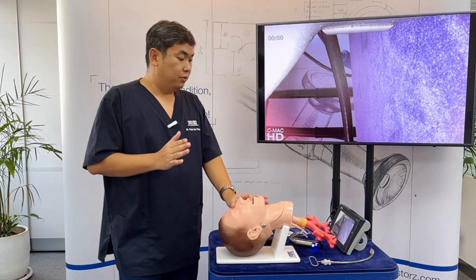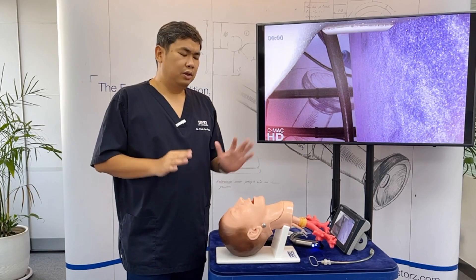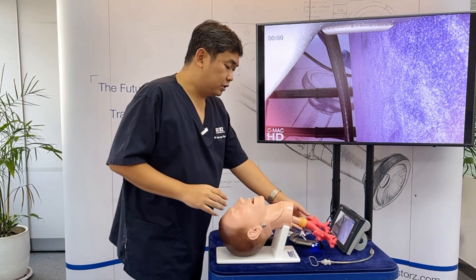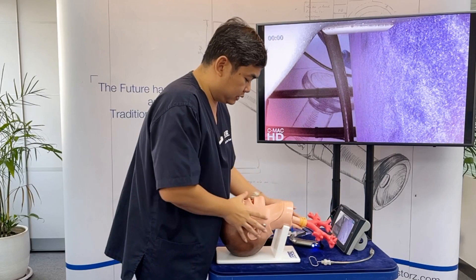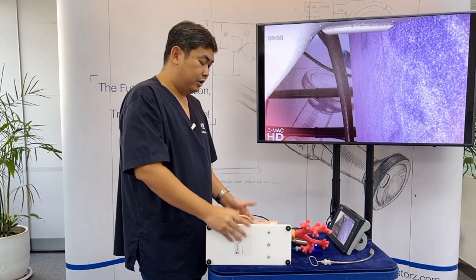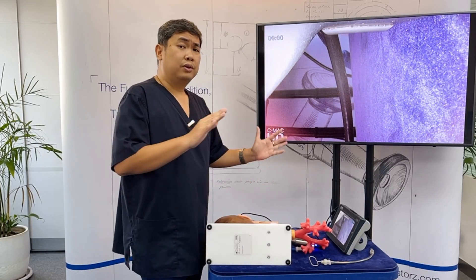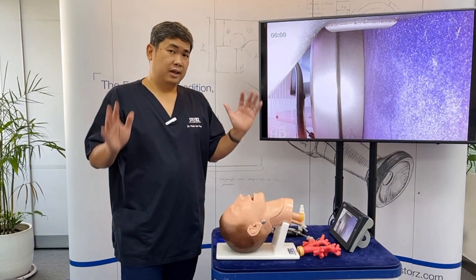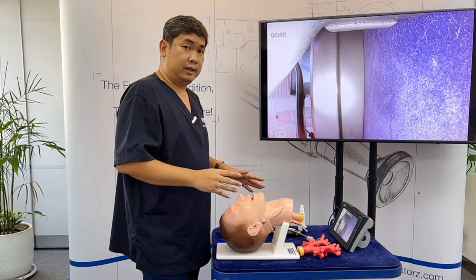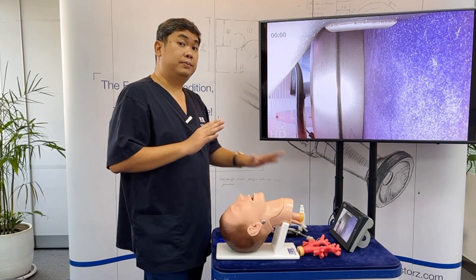Lastly, with a big screen and a good view, you can intubate patients in different positions — while the patient is on their side, prone, or even sitting down. Illustrate this to participants and have them practice intubating the mannequin in different positions.